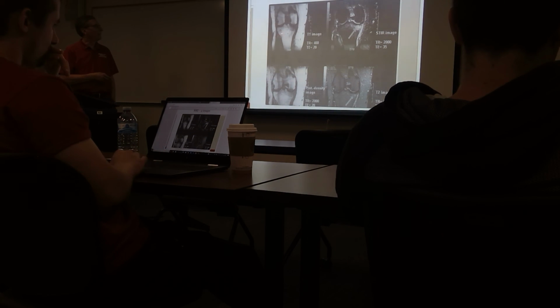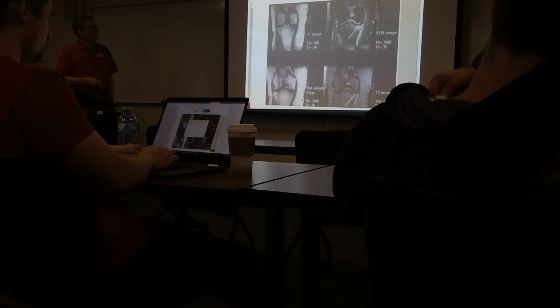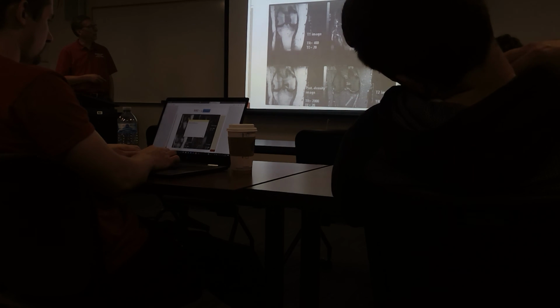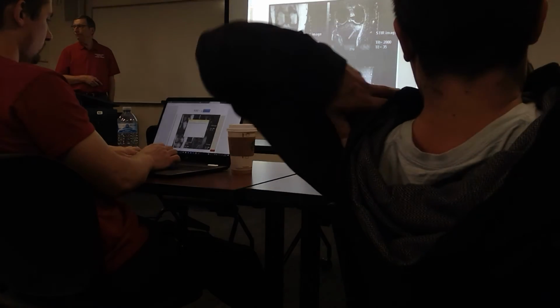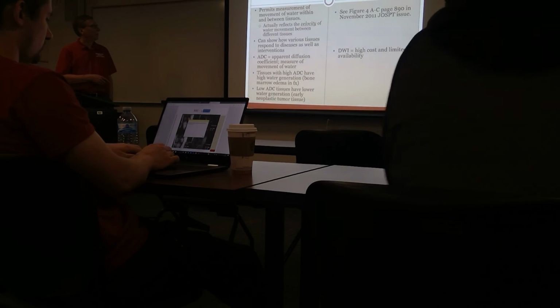So obviously, you see the tibia doesn't look quite right here, it's a little dark. It looks a little shady here. You see kind of a grayish delineation here, but all of a sudden, this one highlights there's a real change in the tissue. So just take that for what it's worth right now.